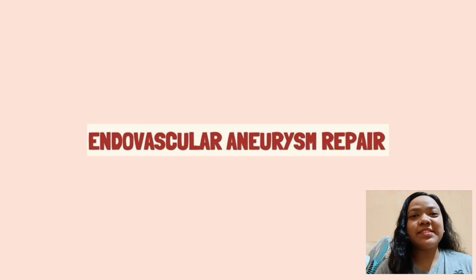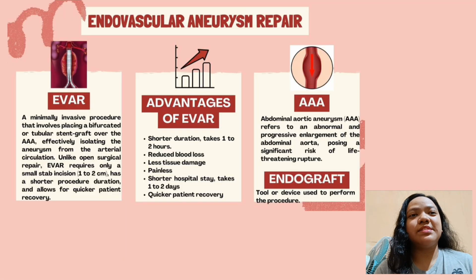Okay, so next is the EVAR. It is the endovascular aneurysm repair. It is a minimally invasive procedure that involves placing a bifurcated or tubular stent graft over the AAA, effectively isolating the aneurysm from the arterial circulation.